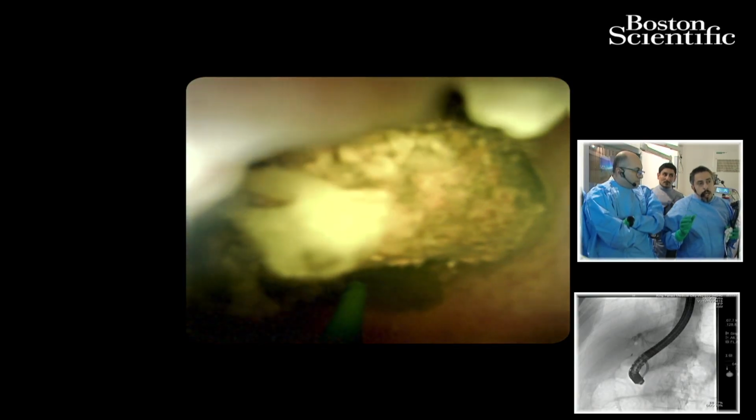Yeah. The most tricky and challenging part that I actually encountered is passing the probe through the cholangioscope. You really need to make sure that your scopes are not kinked and there is not much looping, as straight as possible. Sometimes it's very tricky if you have a distal CBD stricture or the stone is distal.